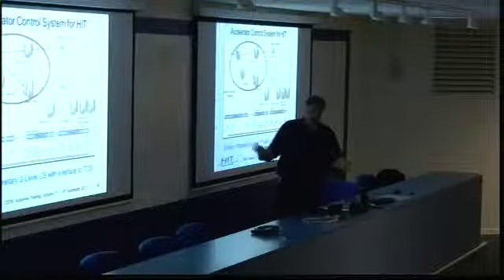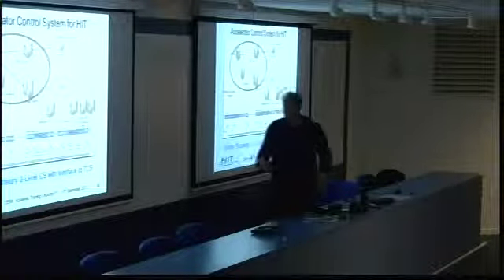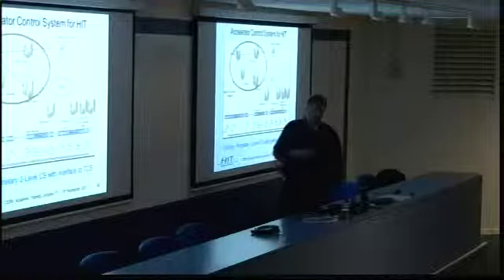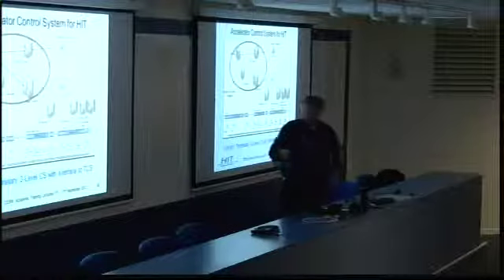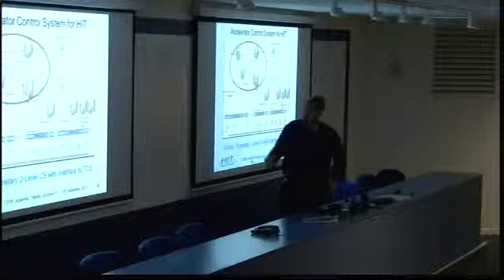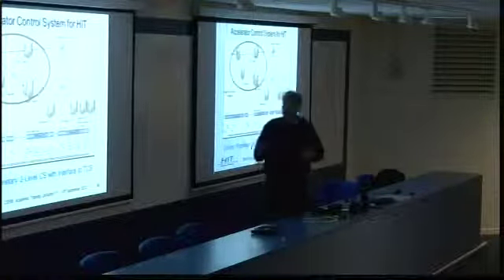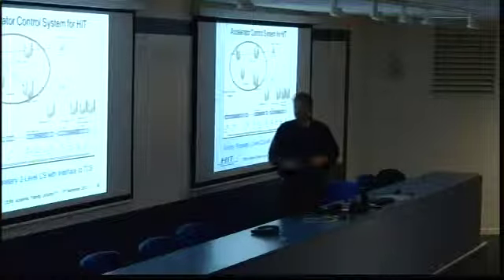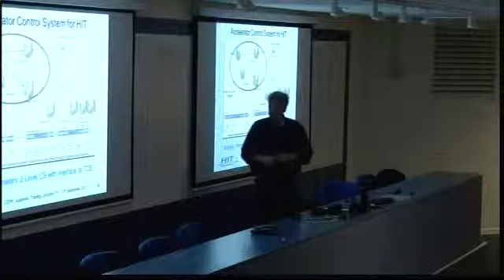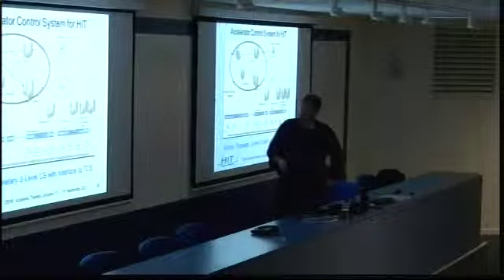In the other case, you have a lot of combinations of energies and focus and so on. Not for all elements, but for some of them. Especially for the devices on the gantry, we have angle-dependent settings, so they need a big memory. So we have RAM memory for bringing and tuning the beam. And if we fix them and they are qualified by our medical physicists, then we bring these values to flash memory where they are stored and then they are safe.